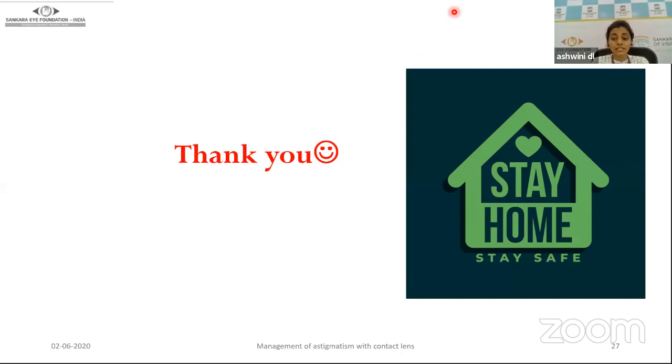In case the rotation is less than 20 degrees, then you can do a compensation with the prescription, and then go with the trial lens to the final contact lens prescription. Whereas if it is more than 20 degrees, it's better to change the company of the contact lens, or rather than the company, you can change the stabilization technique. You can try another contact lens option. If, even with the same stabilization technique in a soft toric contact lens, you still see more than 20-degree rotation, then it's better to think about giving an RGP.